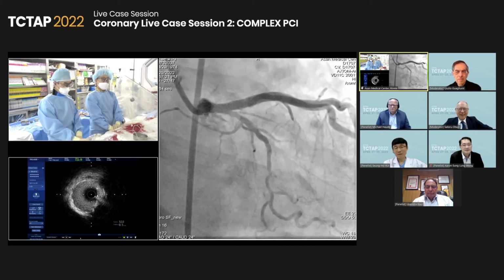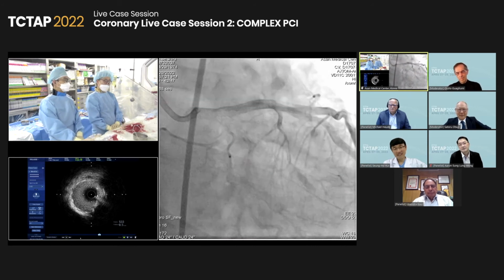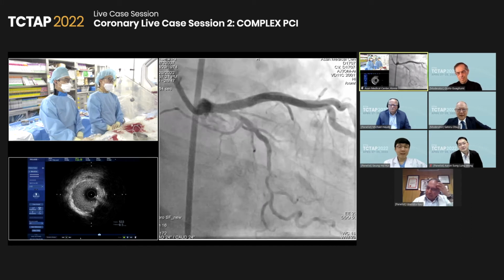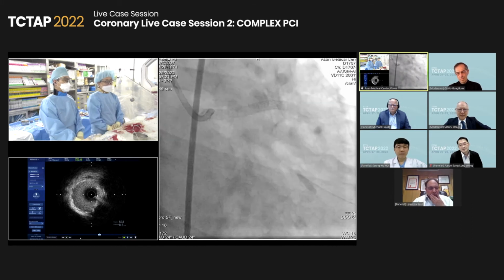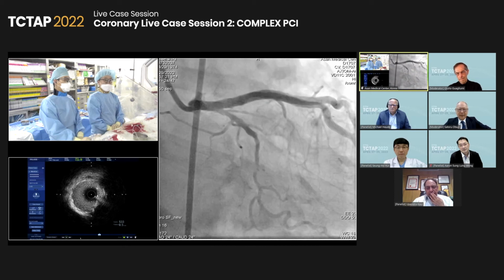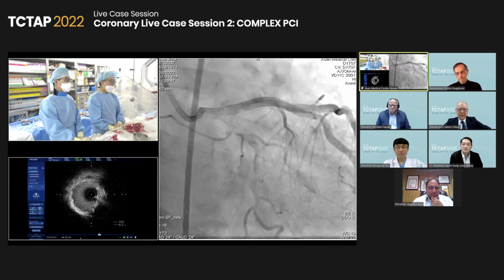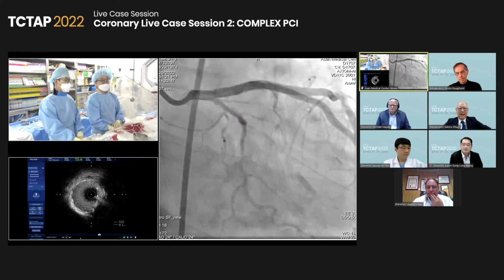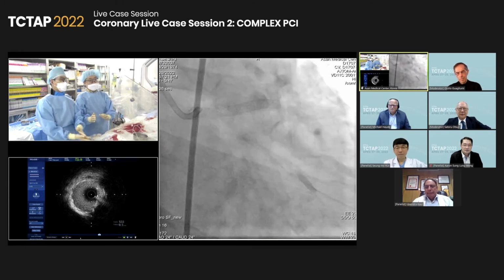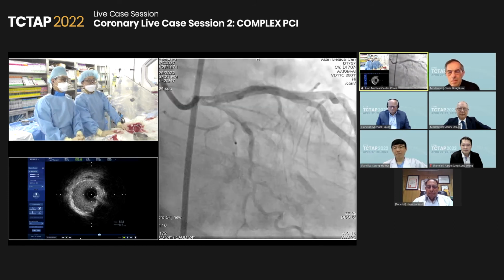Yeah, I think that is a very interesting debatable point, and some physicians recommend the drug-coated balloon. I don't know. We don't have enough data, and I know in the United States they don't have any DCB data. But in the European countries, Julia, do you have some data for the side branch use of DCB? There was some issue about side branch treatment with DCB.